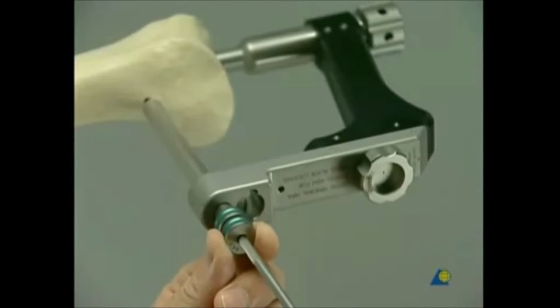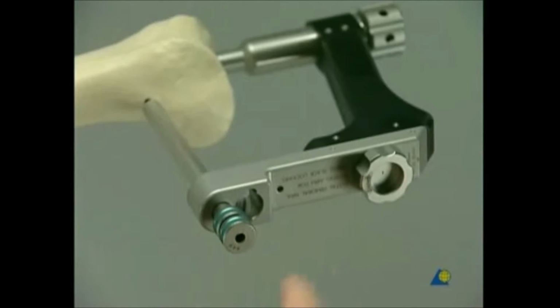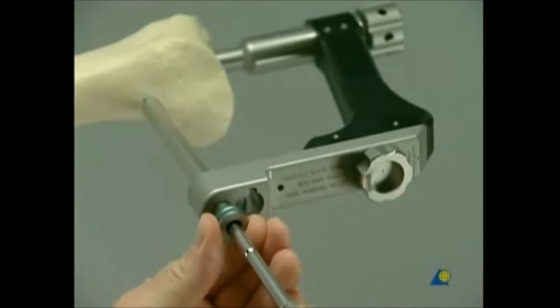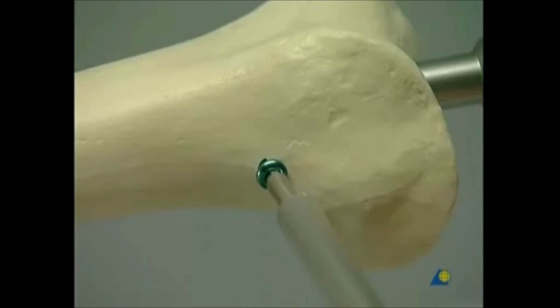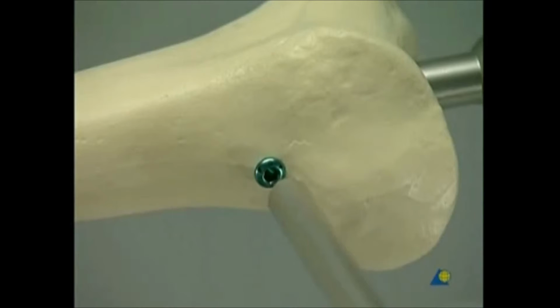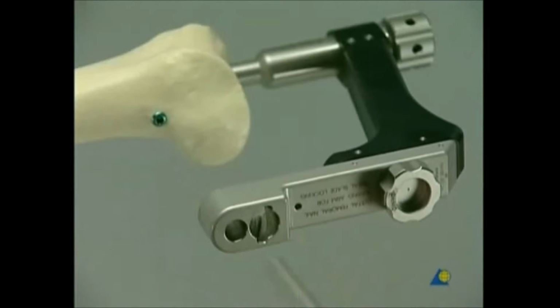Both the drill bit and the drill sleeve are removed. The locking screw is inserted through the protection sleeve using the hexagonal screwdriver and screwed into the bone until the head of the screw touches the lateral cortex. Then the protection sleeve is removed.